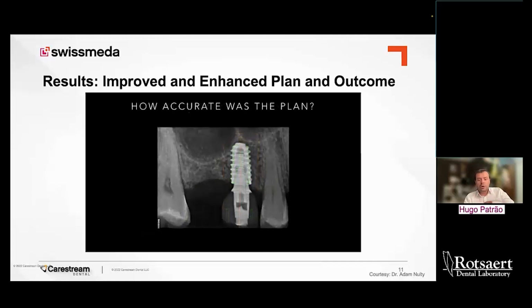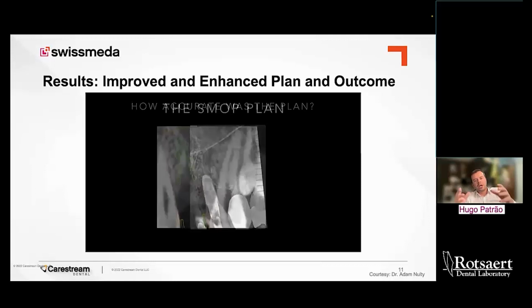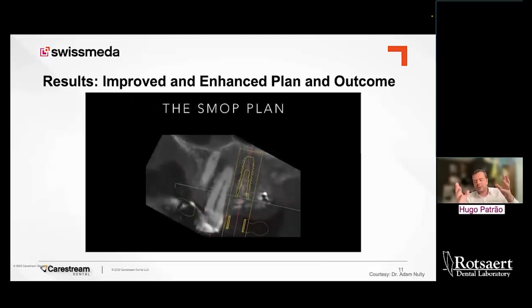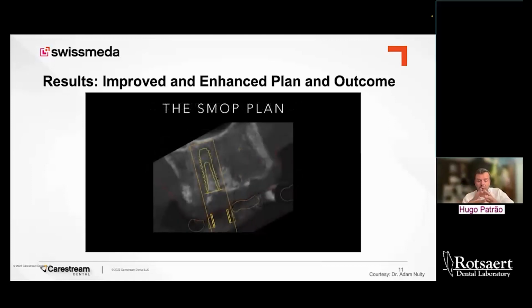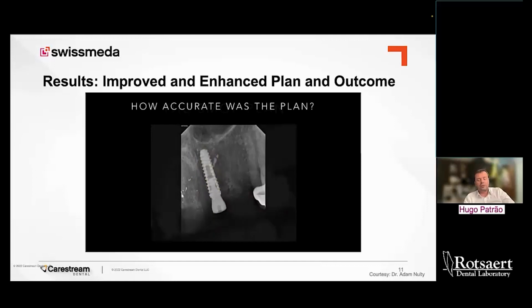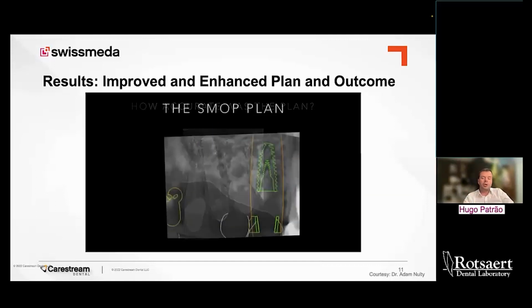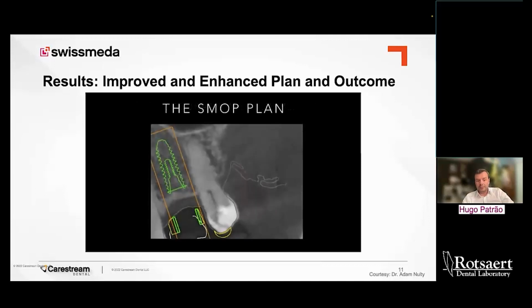So no more placing an implant, a healing abutment on top of that, and asking the patient to come back in 3 weeks or 5 weeks or 6 weeks, whatever it is, to have the crown placed. In some of the cases, and maybe the majority of single cases, you will be able to load it directly with a pre-made crown, which is much simpler and easier to plan.